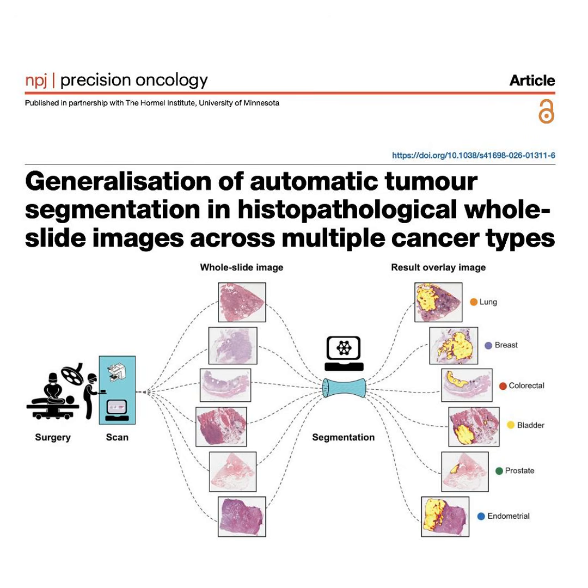But a surgeon or a pathologist doesn't want a blurry, blended heat map when they're trying to understand the borders of a tumor. They need a definitive, hard boundary. They need to know exactly where to cut. Right. So the final step of the pipeline is a post-processing technique to clean up the map, which they call hysteresis thresholding. Hysteresis thresholding is brilliant because it uses 2 thresholds instead of 1. How does that work? The model essentially says, okay, if a region has a probability above 90%, I am definitively marking it as a tumor. That is my anchor. Makes sense.